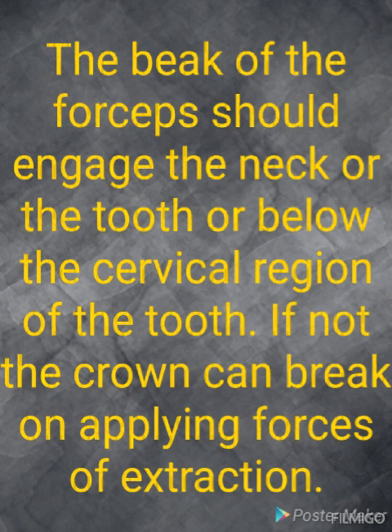That way the PDL is torn, and it is easy for extraction. The beak of the forceps should engage the neck of the tooth, or below the cervical region of the tooth. If not, the crown can break on applying forces of extraction. So we have to place the beak of the forceps to engage the neck of the tooth, or below the cervical region.